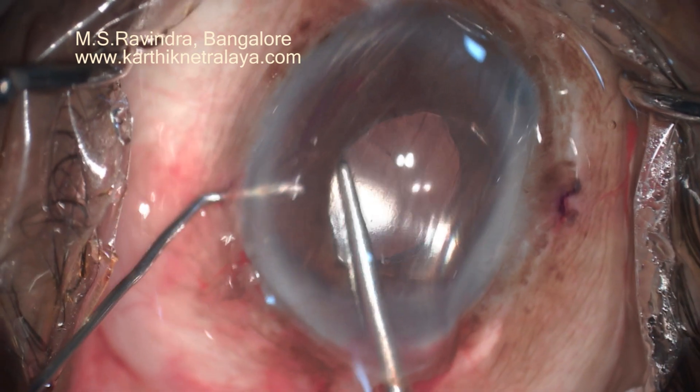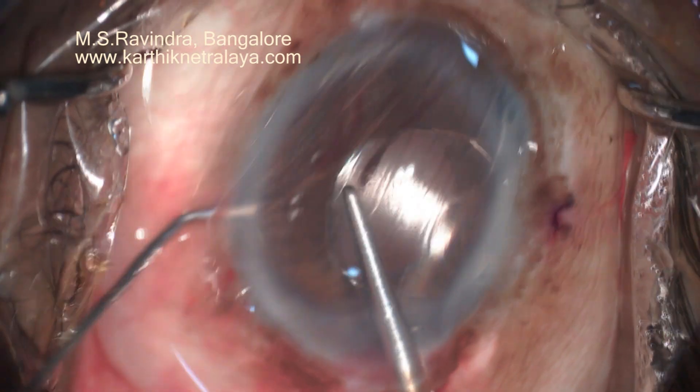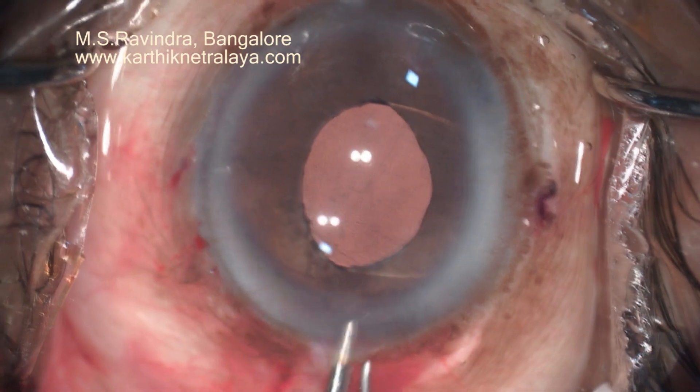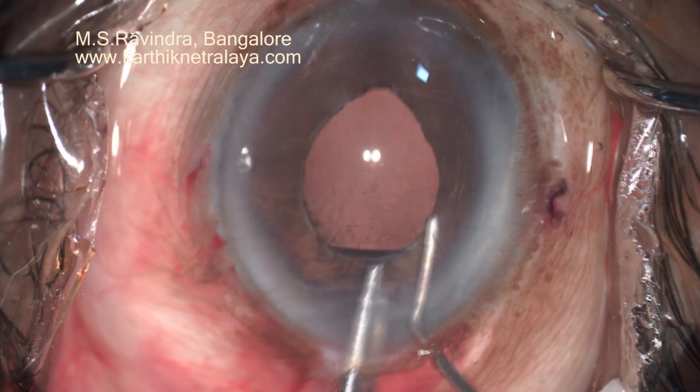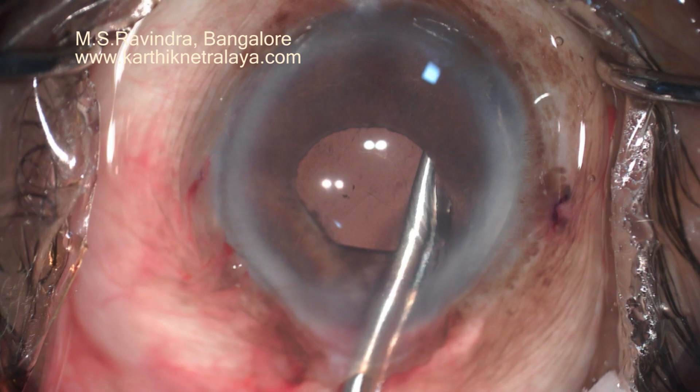Similar procedure is done for the superior haptic. The pupil is around 3 mm and circular, so that post-operative elongation of the pupil does not occur. We then see the round pupil of optimal size.